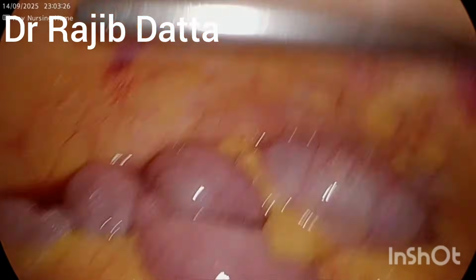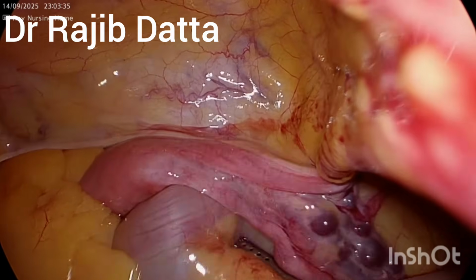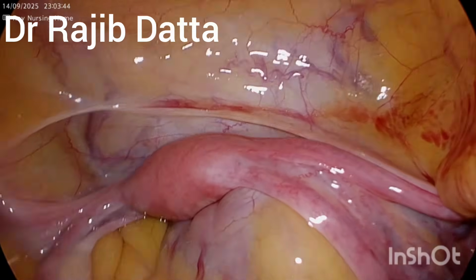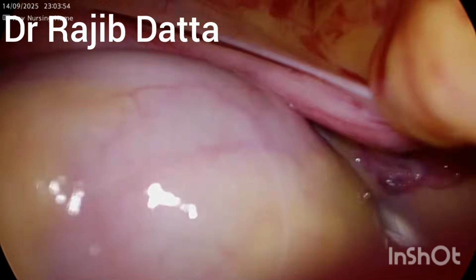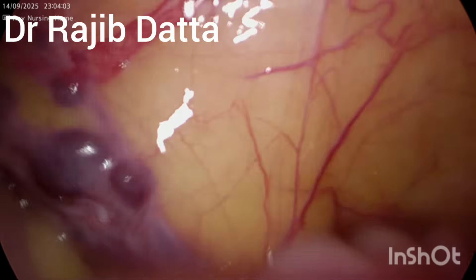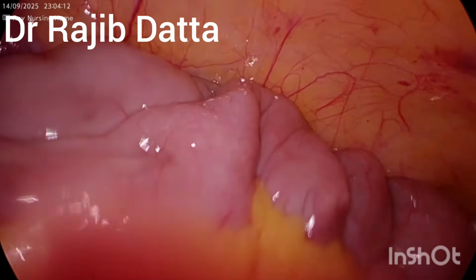Just going to see any fluids. The uterus, you can see the abnormal changes, the distended gut loop, engorged veins at the ovarian ligament can also be visualized.